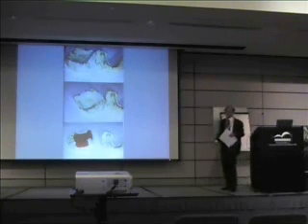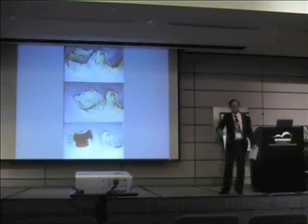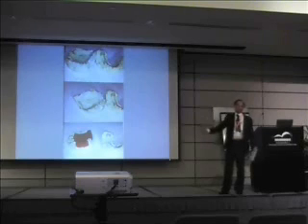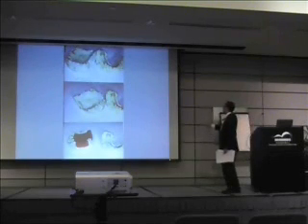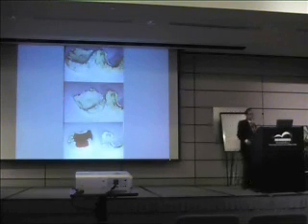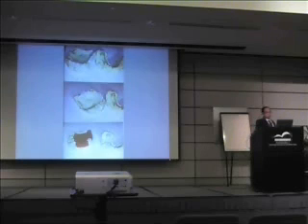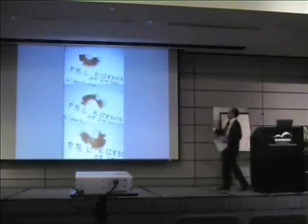The lab is confused. Why do you make a denture with that kind of spacing there? But it's difficult to explain to the lab. You just tell them to make the denture how I told you. That's all. So you put a block here and you put a block there, and you'll see the reason for this block. Your denture comes back with its holes done up.